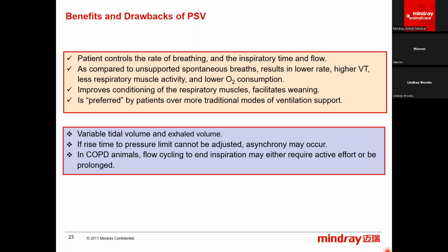And it is quote unquote preferred by patients over more traditional modes, meaning your patient isn't fighting the ventilator as much. They can breathe much more easily. It's much more comfortable for them.